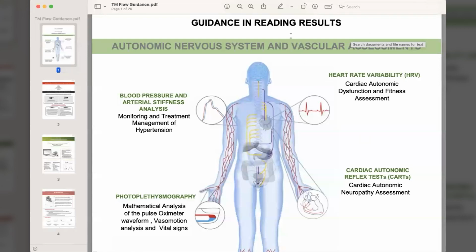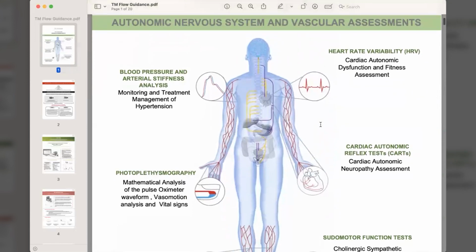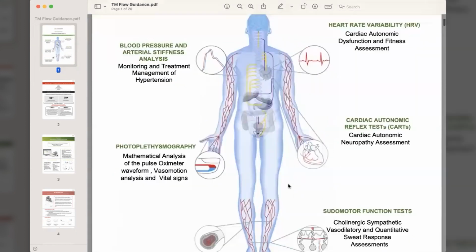All right. So essentially, this is the results interpretation document, and it has a lot of answers to clinical questions that you're going to get from doctors. And they always try to put you on the spot, so I figured I'd take you through it. Most of this stuff we've already talked about all weekend, but there are a few other things, and I just learned about the endothelial function, which is really good.